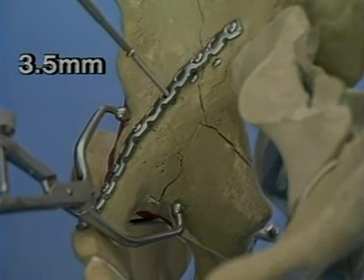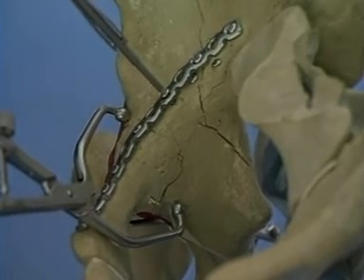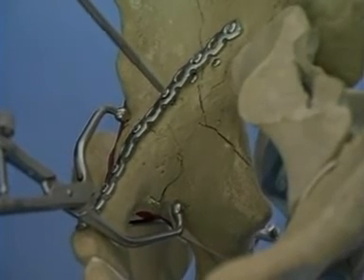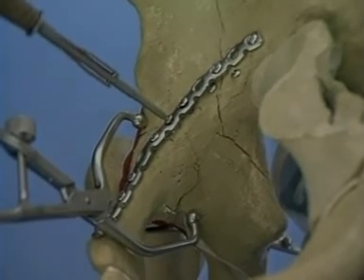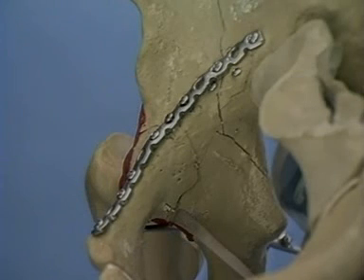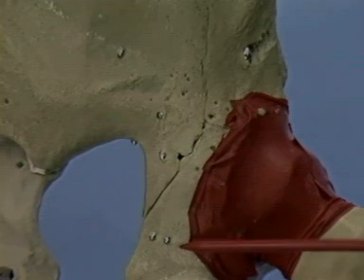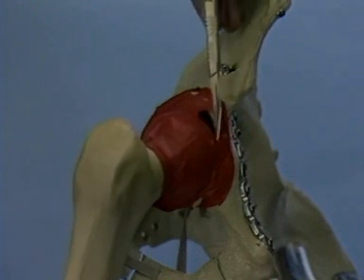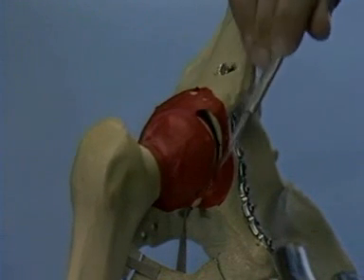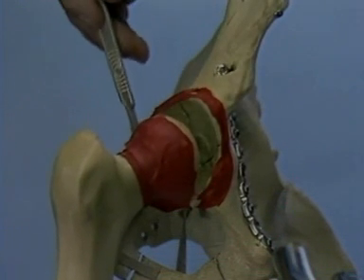The path of the screw is slightly proximal and medial to the joint. On the outer aspect of the bone, the screws fixing the posterior column are seen to exit the retroacetabular surface just above the ischial spine. The final reduction of the articular surface cannot normally be directly visualized; however, for the exercise, we'll open the hip capsule to visualize the articular reduction.